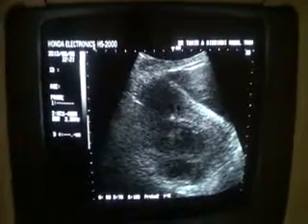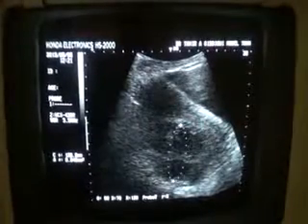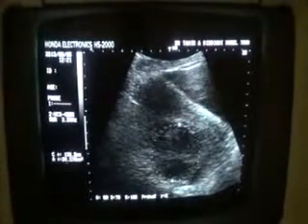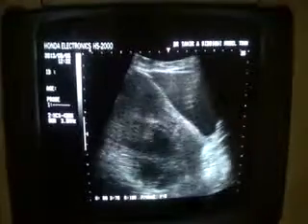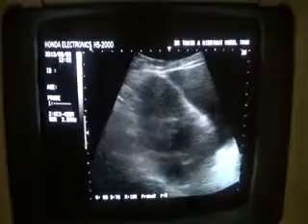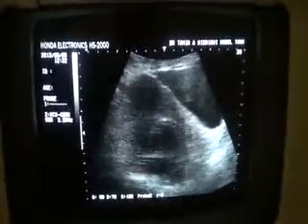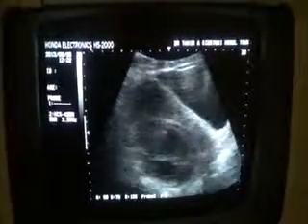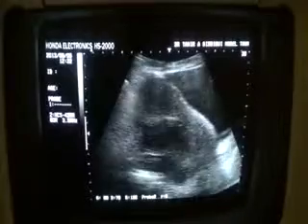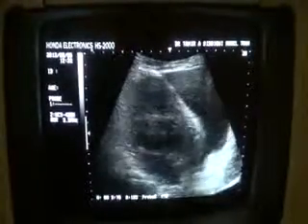This is the urinary bladder, and this is the echo-filled cystic area, which is blood. Keeping in view the history of the patient and the lab findings, you can see that the uterus is being elevated. So this is a case of ruptured ectopic pregnancy seen posterior to the uterus, that is elevating the uterus anteriorly.